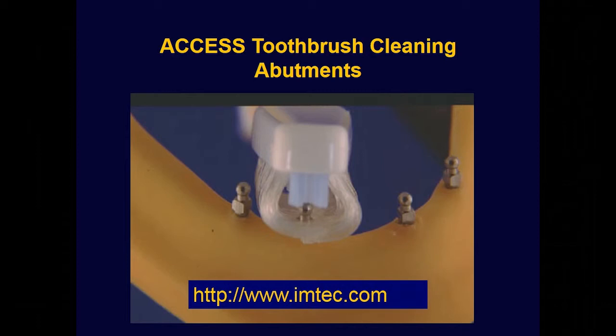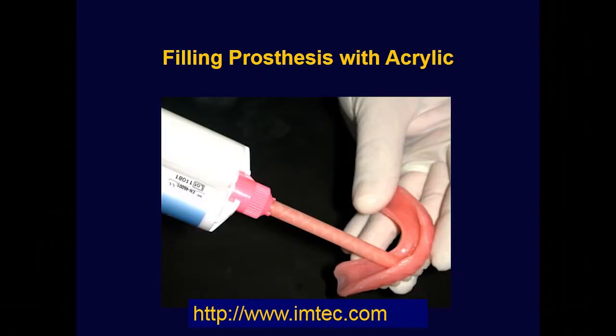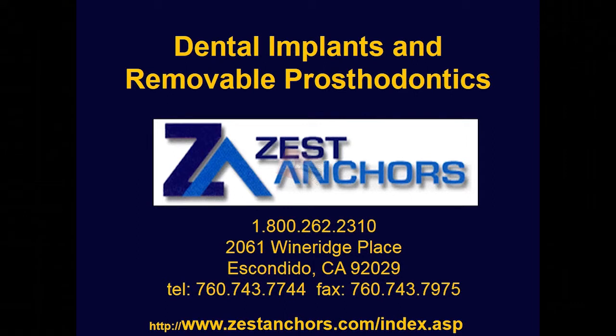This is a brush that we have patients use as an access brush from IMTech. It is good to use around these O-balls as well as locator attachments because it's got this curve design, and you have something that scrubs the top of the cap also. So it really is pretty slick. I don't use this stuff. We use acrylic. We've used different things that are commercially available. They come in guns and all that. But we pretty much use acrylic for the most part.